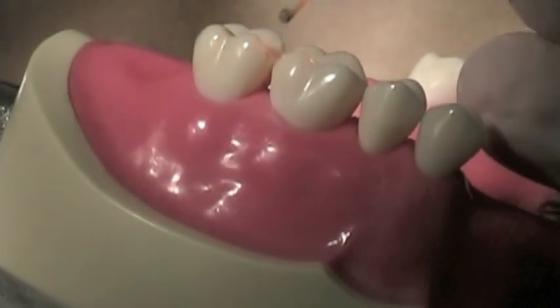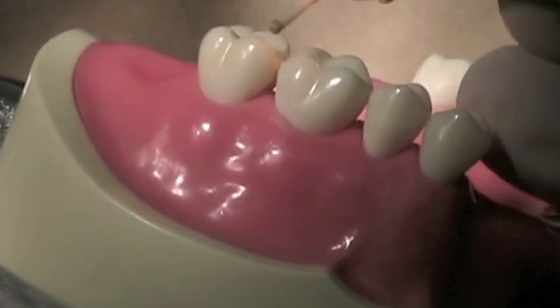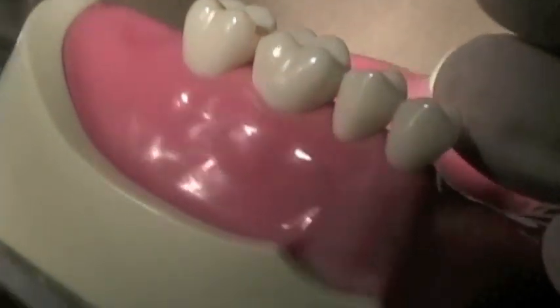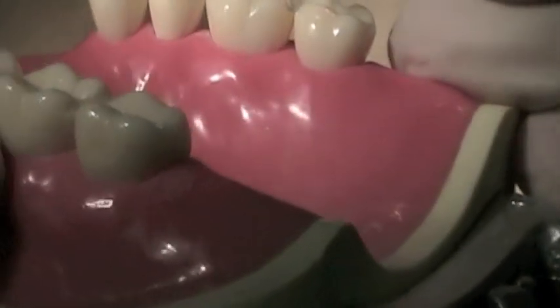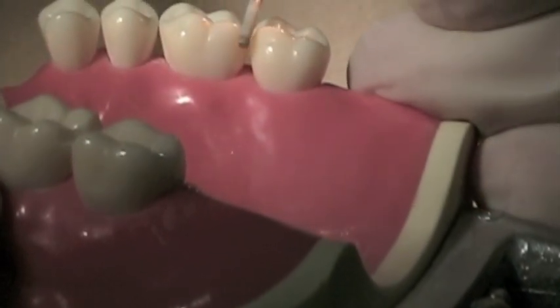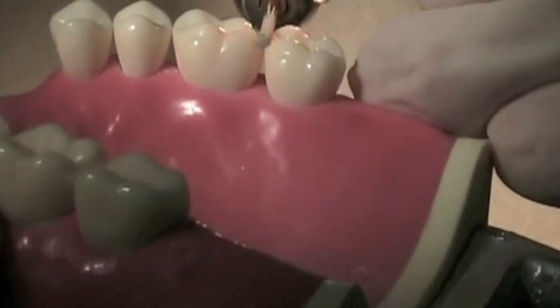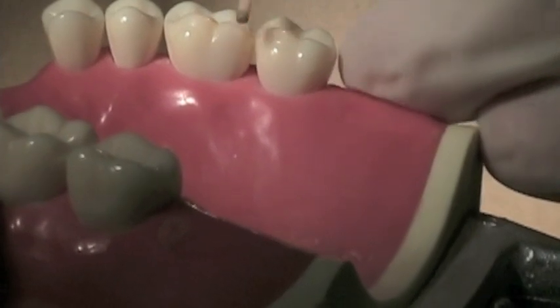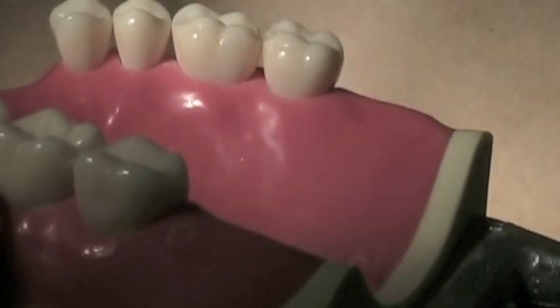Next, smooth out any sharp angles on the buccal and lingual surfaces to minimize areas of stress concentration for the clasp, which will be located in these areas. Make sure to not have any sharp angles in these areas.